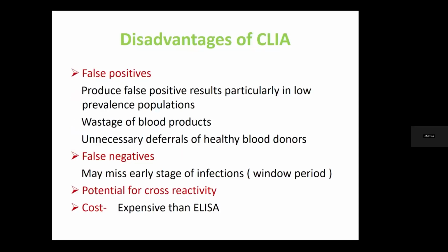Now the disadvantages. As it is a very sensitive technique, it gives many false positive results, particularly in low prevalence populations. So it leads to wastage of many blood products, and there is unnecessary deferral of healthy blood donors.